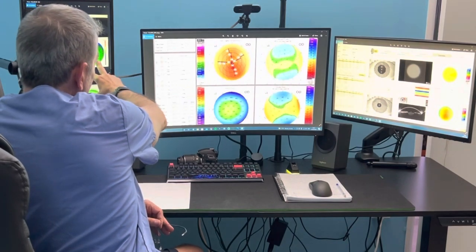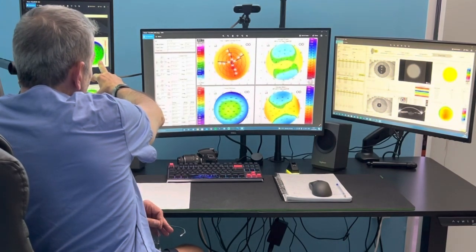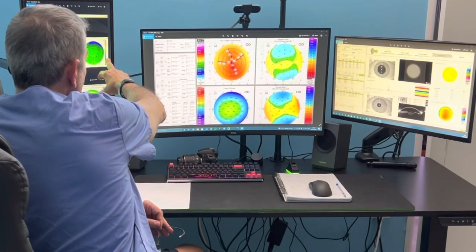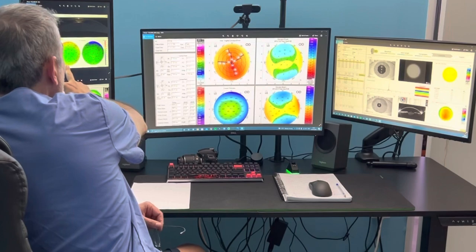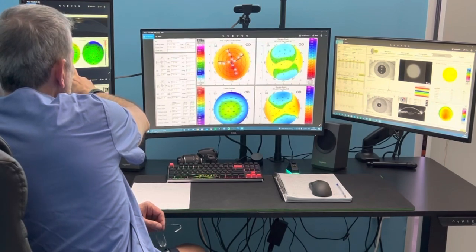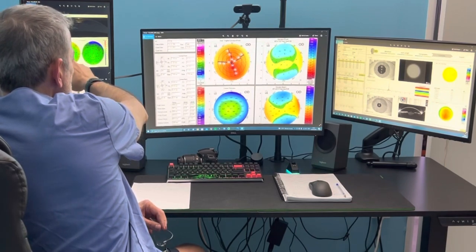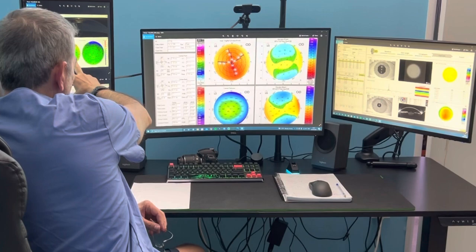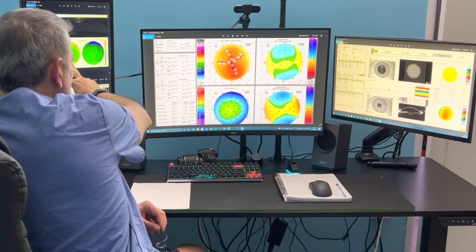We're seeing here this is a young lady. We have relatively good epithelial maps. The cornea thickness, on the other hand, tells me that the distribution of the corneal pachymetry is relatively good.